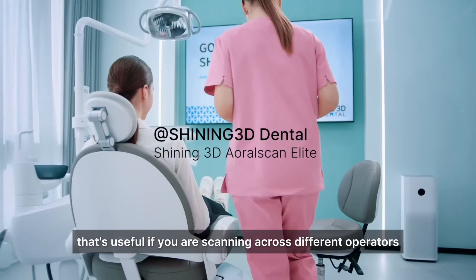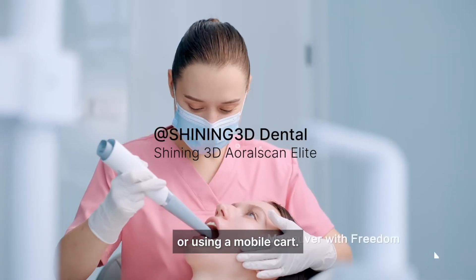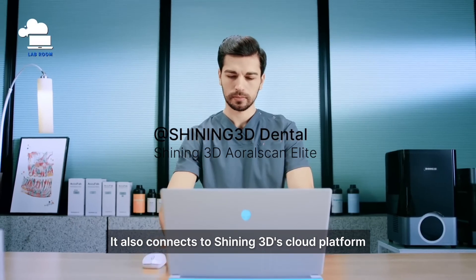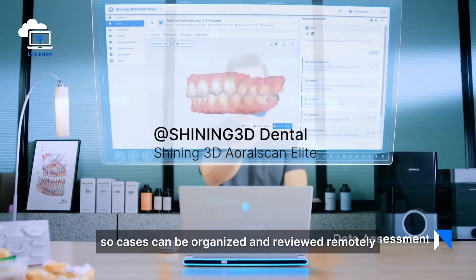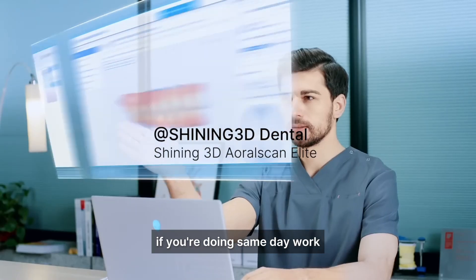You can run this Elite Wireless, which is useful if you're scanning across different operators or using a mobile cart. It also connects to Shining 3D's cloud platform, so cases can be organized and reviewed remotely. And it's compatible with chair-side software if you're doing same-day work.